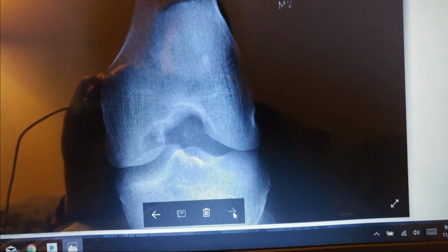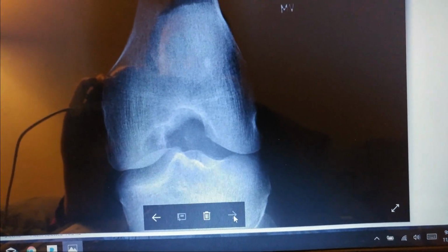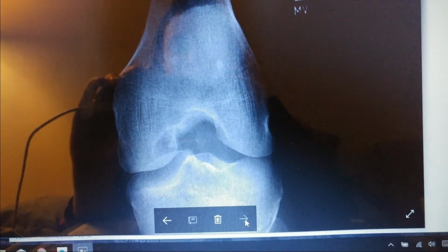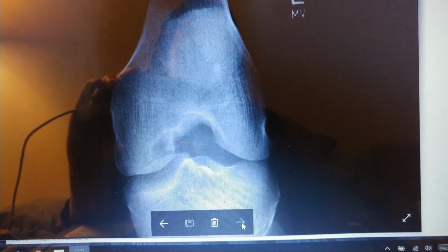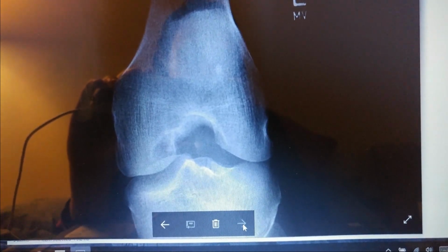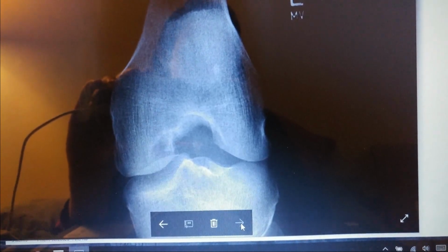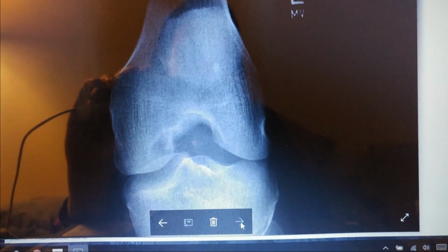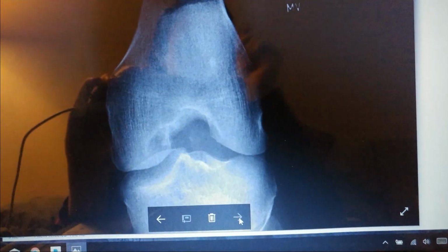The central ray is perpendicular to the long axis of the lower leg. So you just kind of have to angle it with however the lower leg is angled and when it's flexed. It also enters 1/2 of an inch distal to the patellar apex, similar to the AP projection and the AP oblique projection. So mainly we just want the intercondylar fossa to be open. That's the most important part here.